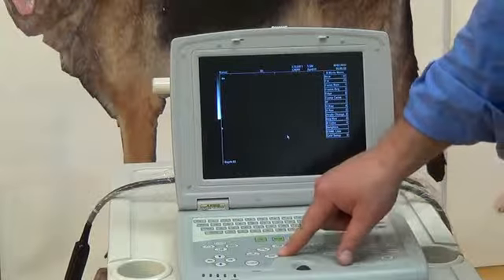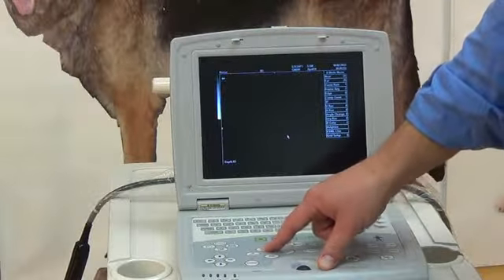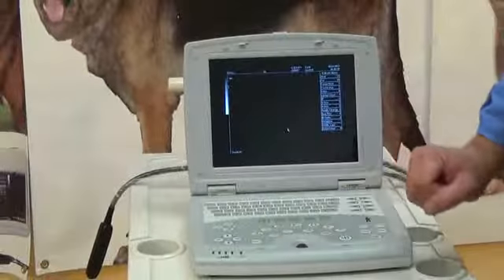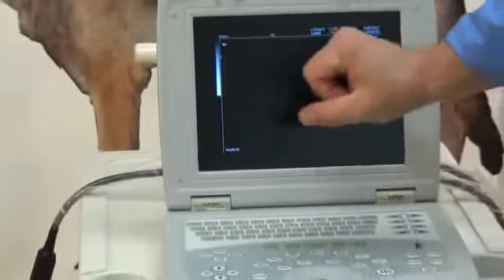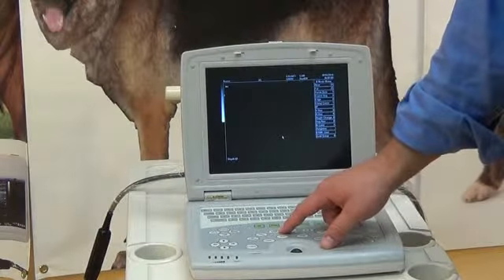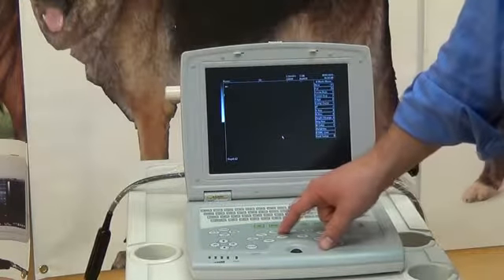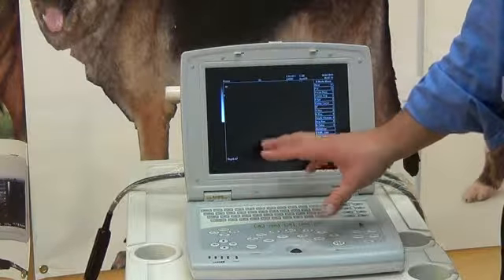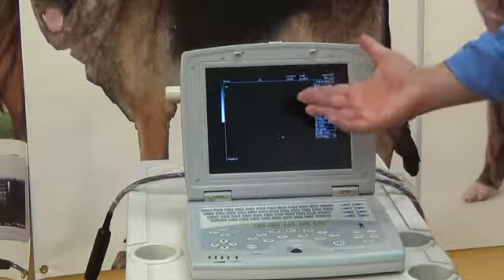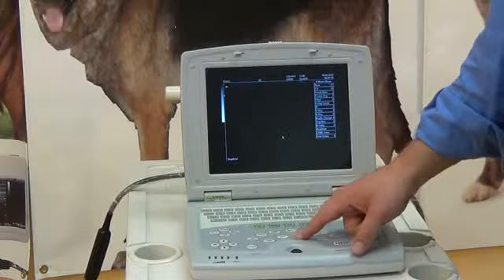We have our set button, which basically we use to set our measurements. This button here, magnifying glass, is somewhat self-explanatory. You zoom in. You can't really see this well here because we don't have an image, but it just does an overall zoom. This right here is a button that's used for frame compression. That's something that you can use to change the sharpness of some of the pictures. Not a setting that most people use, but you can play around with it so you figure out how it works in your specific setting.